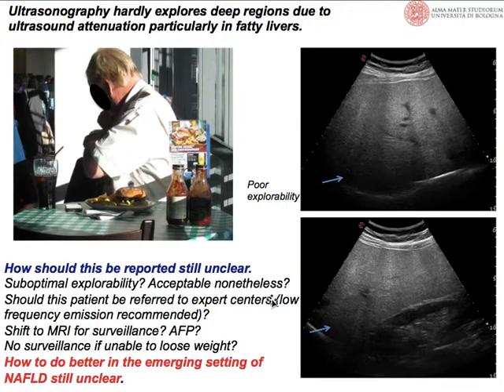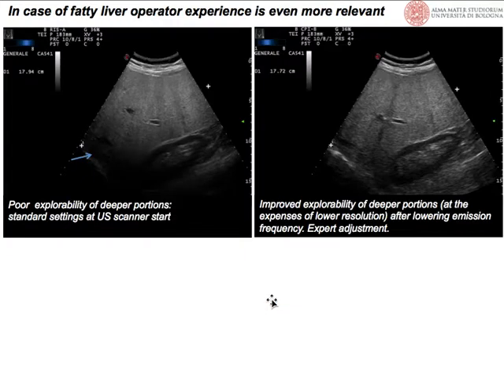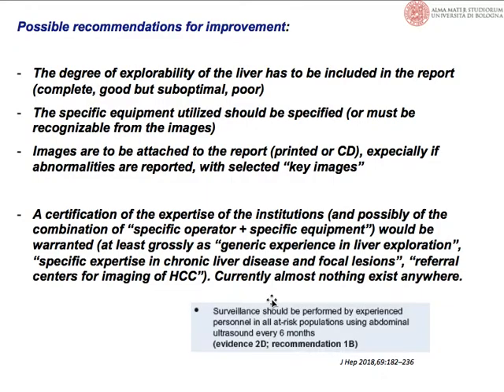might be referred to expert centers, or whether they should receive MRI instead of ultrasonography. And this is still a problem which has no solution. Obviously, experienced operators might adapt the setting of the equipment to improve, for instance, in this case, decreasing the frequency. These are all tiny tricks which not all operators are able to utilize. Therefore, it is strongly recommended that these patients are visited by skilled operators.